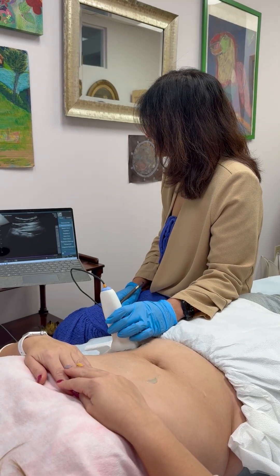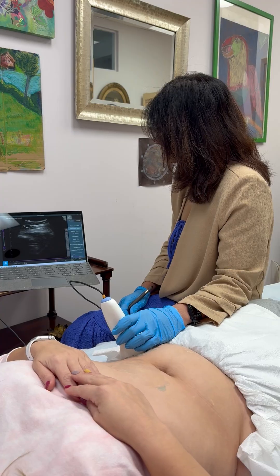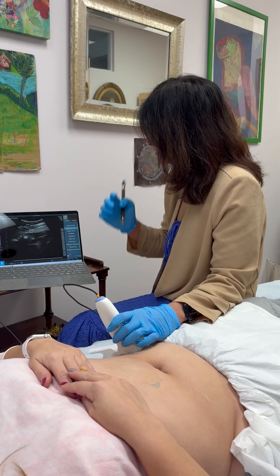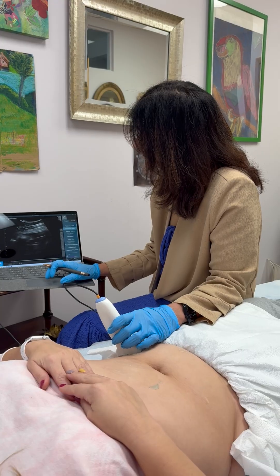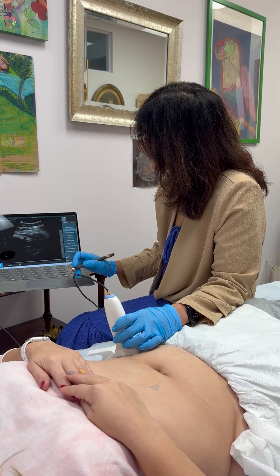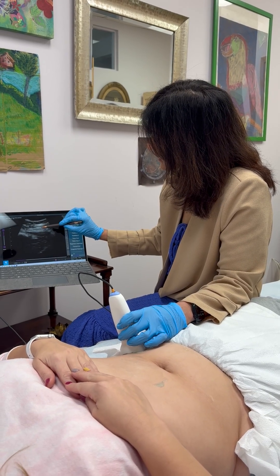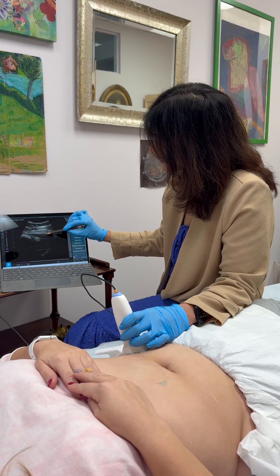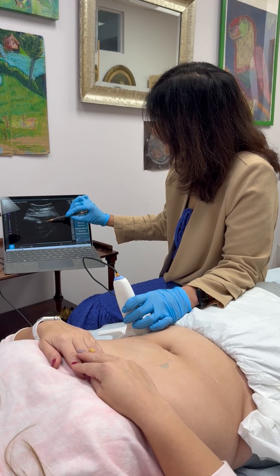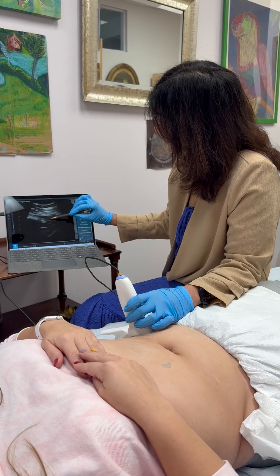Oh look at that — Cecilia, I am so impressed. Okay, so this is your rectus, then we have the external oblique, the internal oblique, and then this teeny guy here is your TA. So we have beautiful layers here.